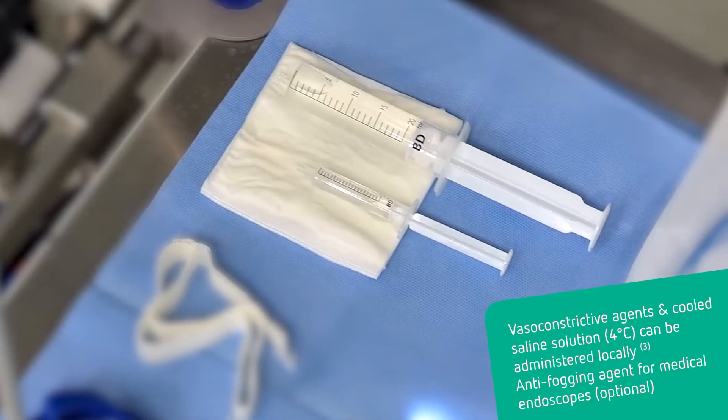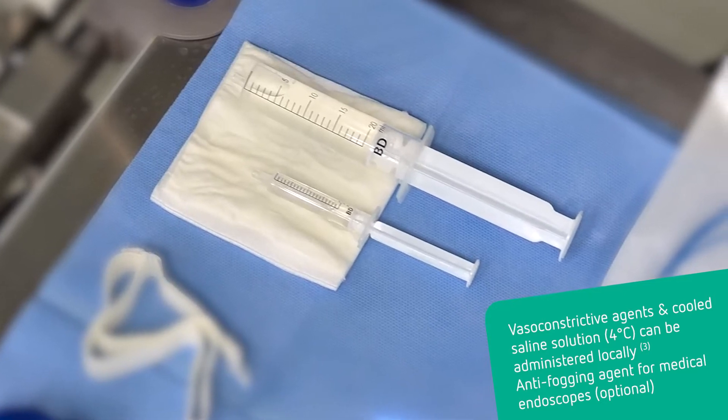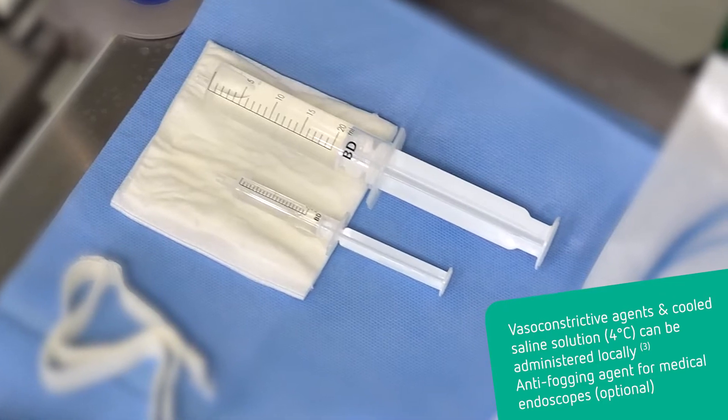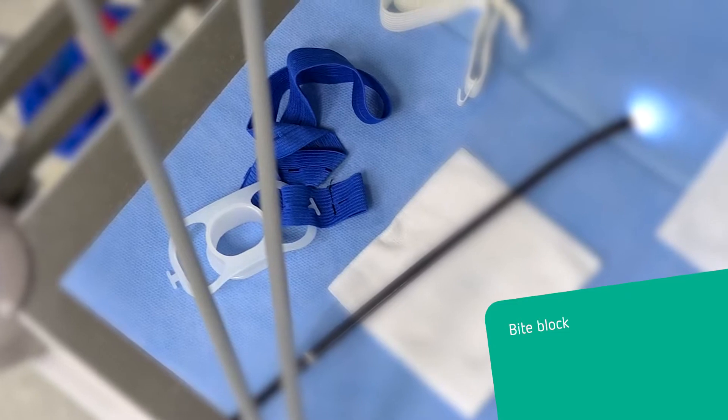Ice-cold saline is available to control any clinically significant bleeding. An anti-fogging agent for medical endoscopes can be used. Depending on the definitive setup, a bite block might be useful as per the bronchoscopist's preference.